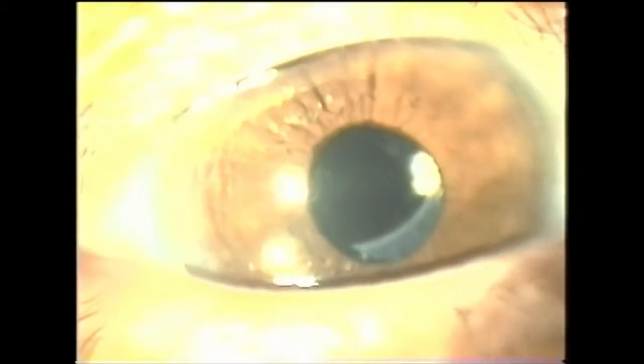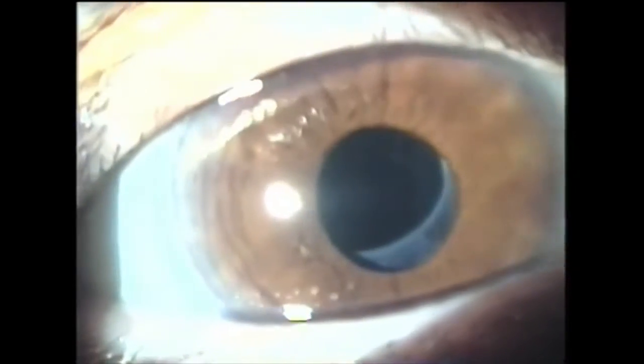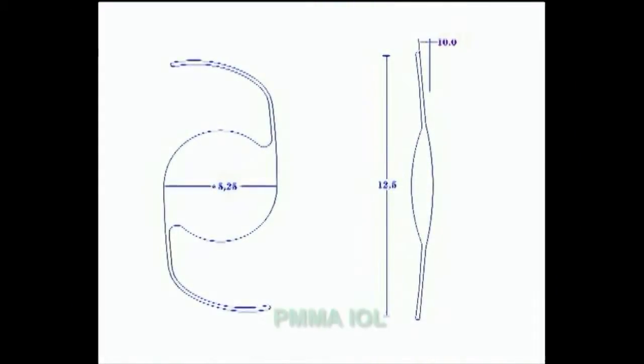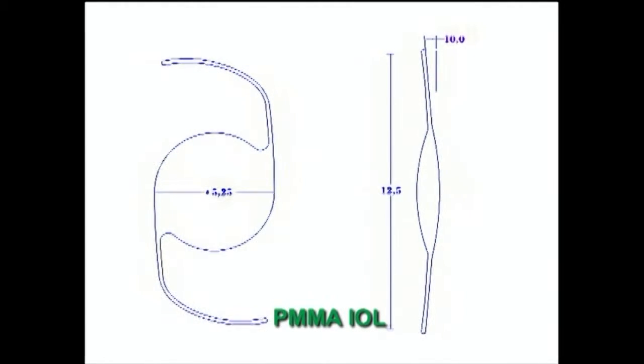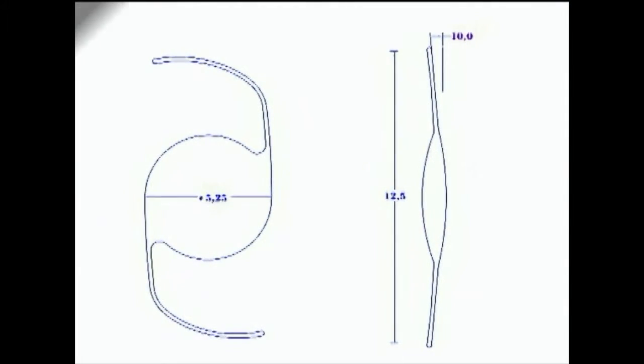than hard clinical evidence. In this video, we will present a case report of a patient with a complaint of a severe positive photic phenomenon managed with piggyback IOL implantation. The patient is a 64-year-old female who underwent uneventful phacoemulsification with an implantation of a one-piece PMMA IOL with a round optic of 5.25 mm, rounded edge, unequal biconvex design, and a 10-degree haptic angulation.